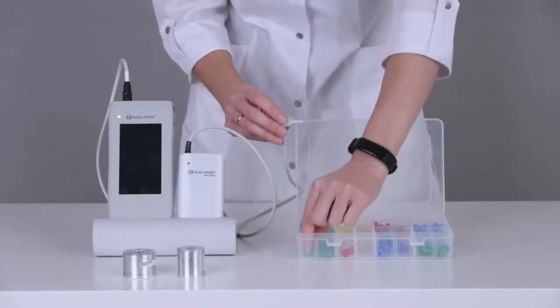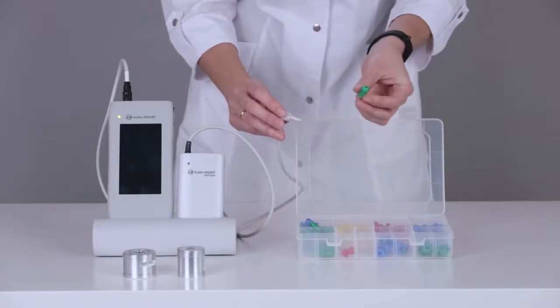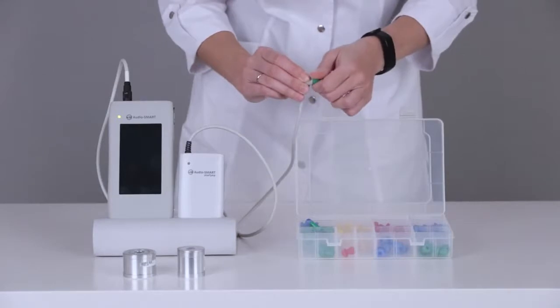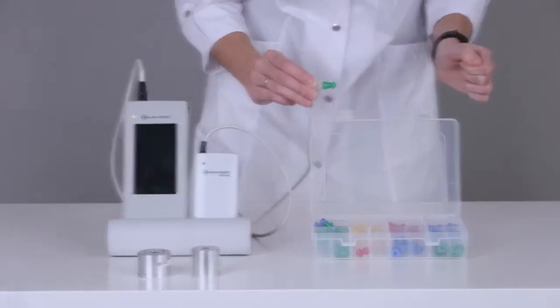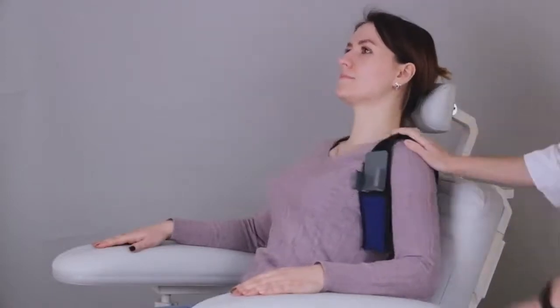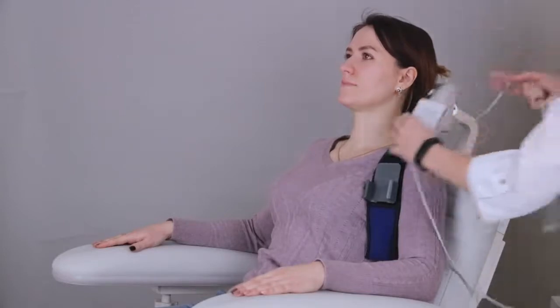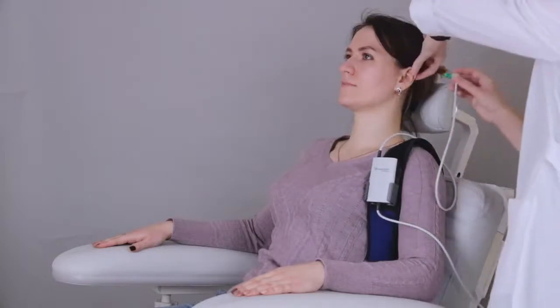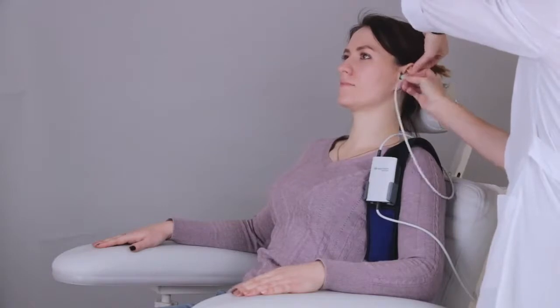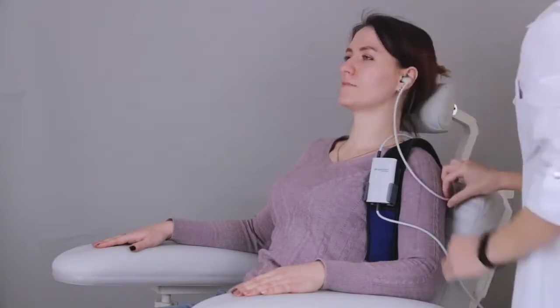We need to choose the proper size and fit of the probe tip and put it tightly on the probe. For comfortable working, we need to place the special shoulder harness on the patient and position the impedance unit here. After that, we need to put the probe tip in with rotating moves deeply enough.